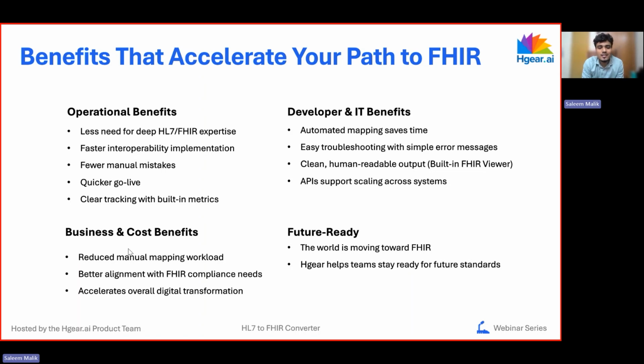If you're an organization, it is definitely going to reduce your workload. You don't need to employ many resources to do one single activity. So HGear is going to cover everything, and it's going to make your work easy.